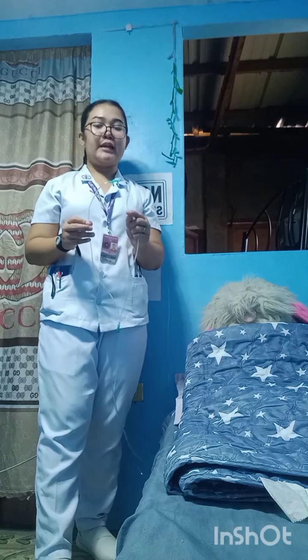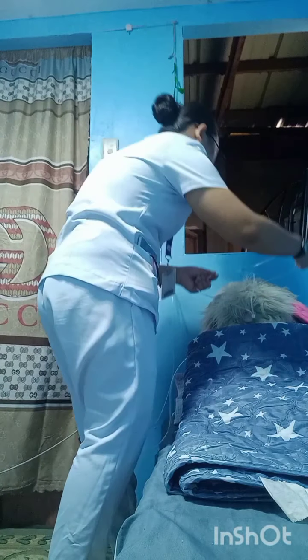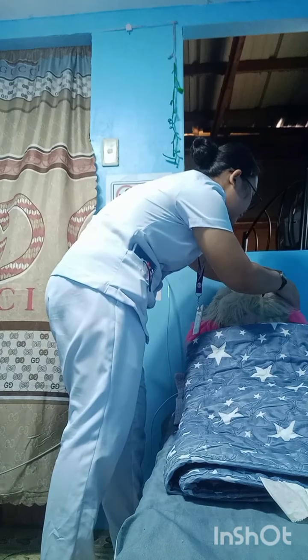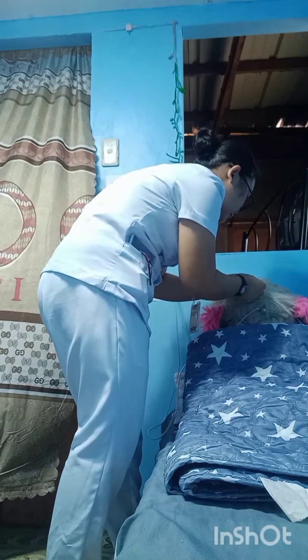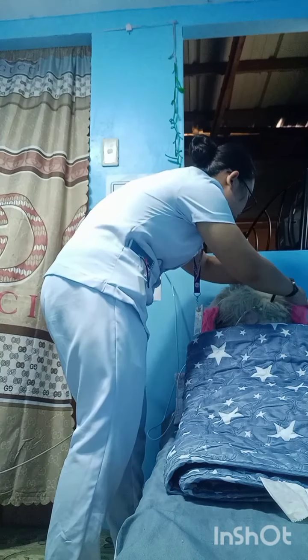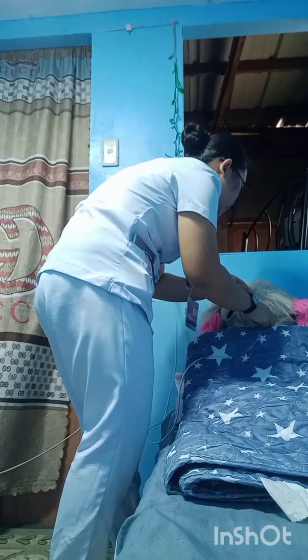So for the application of the ODD, first we're going to put the cannula over the client's face with the outlet prong fitting into the nares and the tubing hooked over the ears. This one.